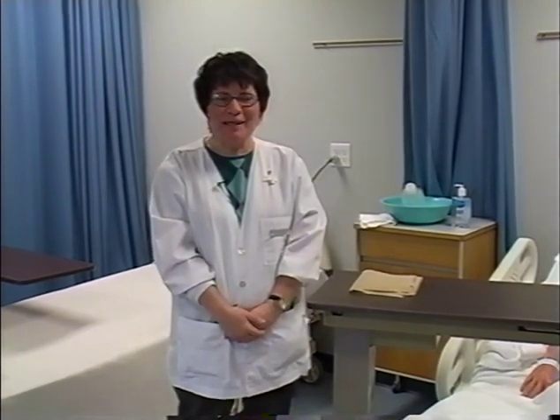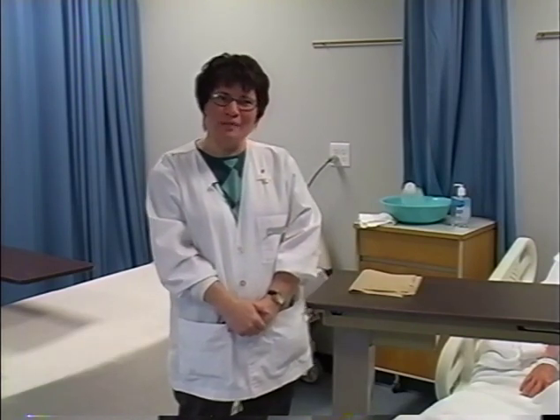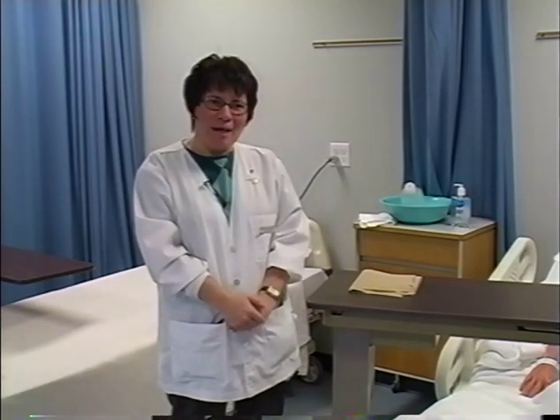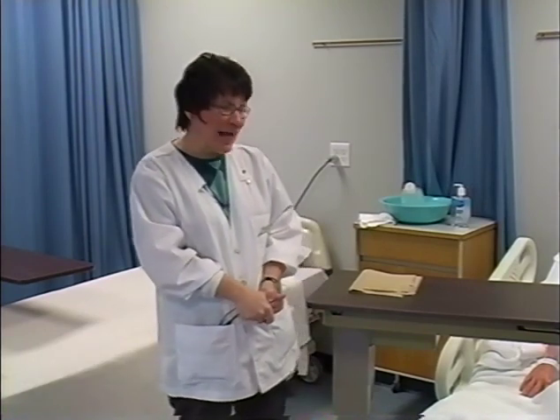Hello. I'm Beth Kroskopf, and I'm going to demonstrate cleansing a wound and applying a simple sterile dressing. I have a physician's order for my patient, Mrs. John A. Lewis. I'm in Mrs. Lewis' room now. The door's closed, the privacy curtains have been pulled. I've just given myself a one-minute hand wash, so I'm going to show you the way I would really change a dressing on an actual patient.